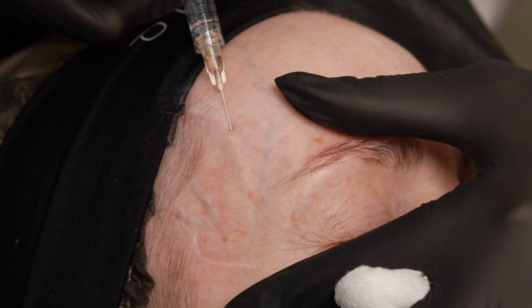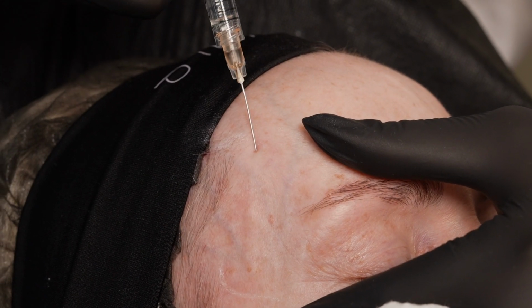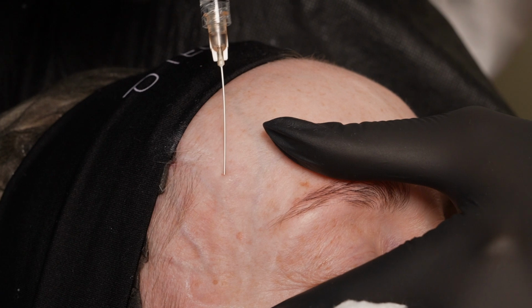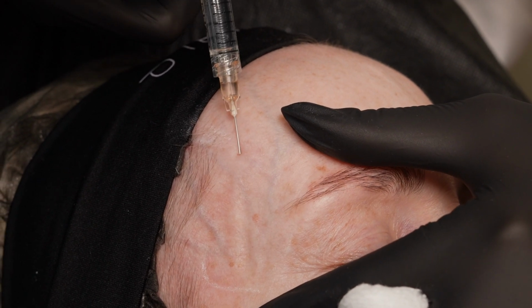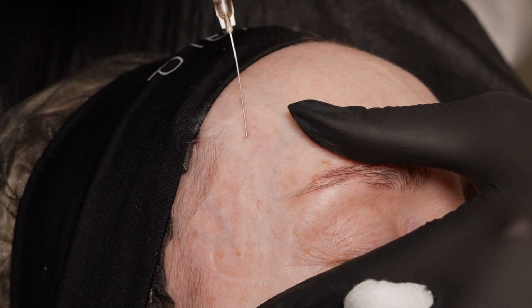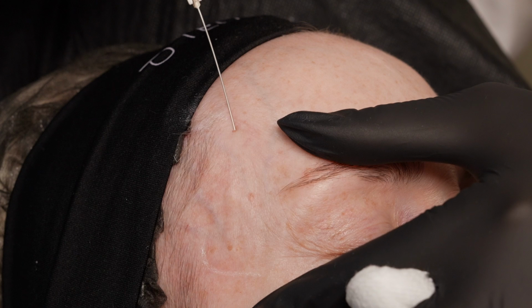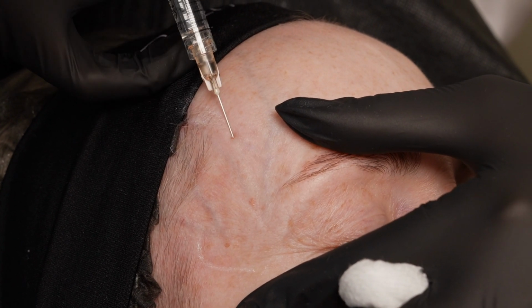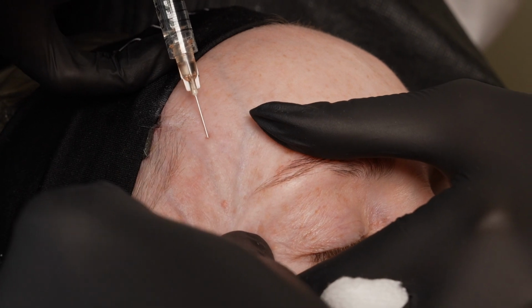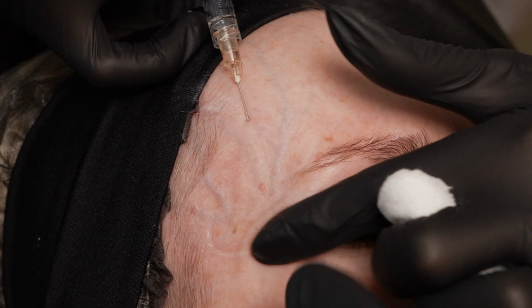You can see it slides easily and is not so painful. Can you see it? Yeah, do it. Perfect. Good. Control with your orbital rim. Don't pass the rim.